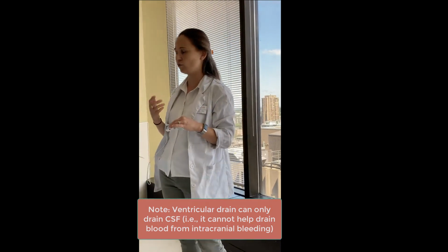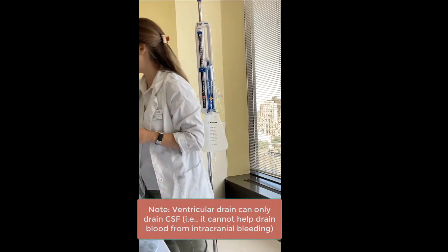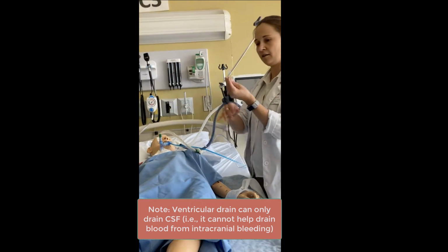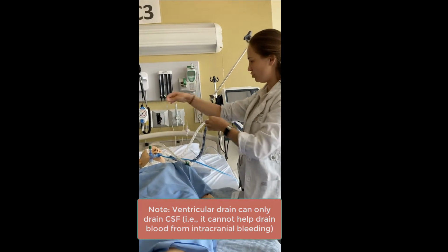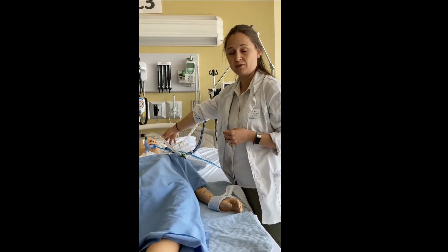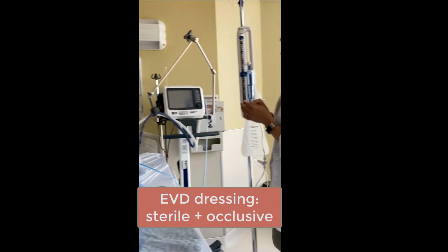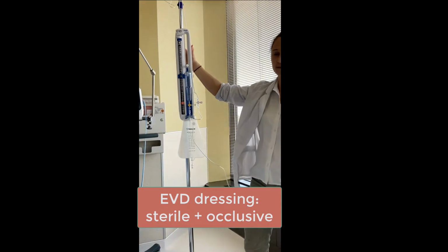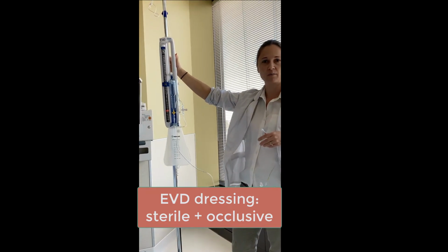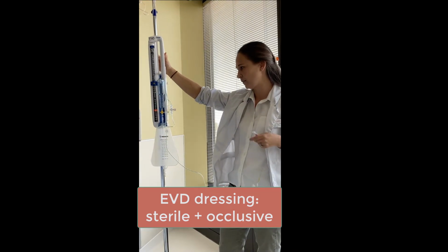So a neurosurgeon would insert a drain into a patient's ventricle. Usually it's done through a burr hole on the patient's frontal lobe. And then this type of a drain would be attached to it and it would sit right there. The dressing on this drain will always be sterile and occlusive. And the procedure for manipulating this drain always has to follow aseptic technique, because obviously if we are accessing something inside of the brain, we have to stay very sterile.